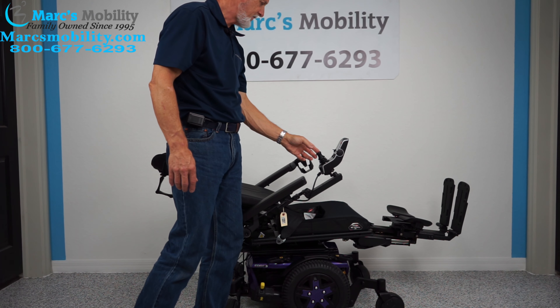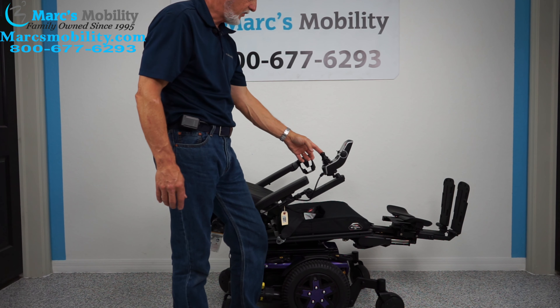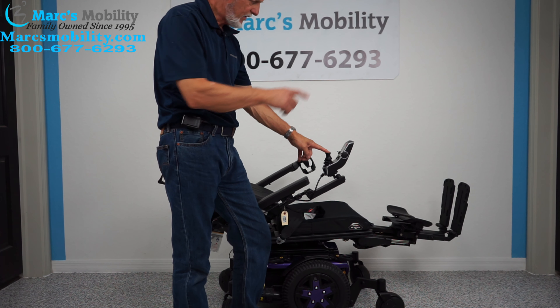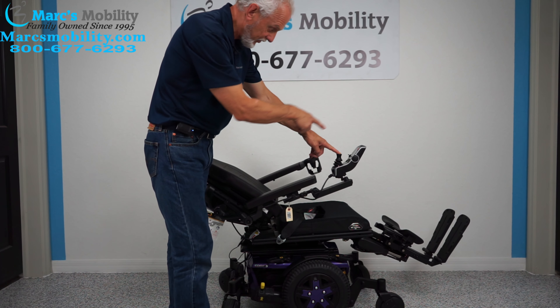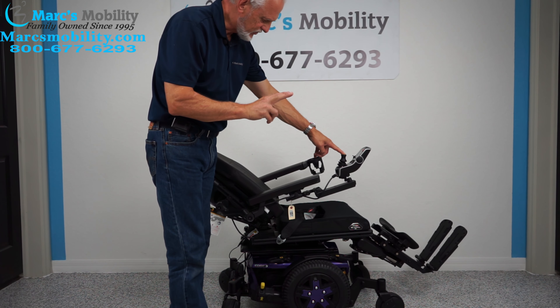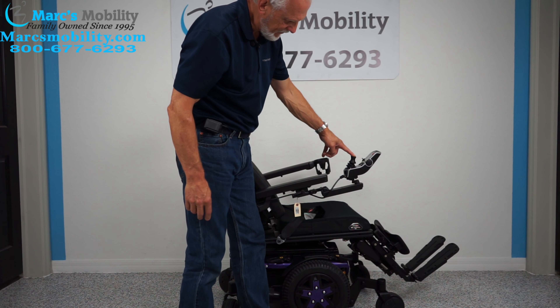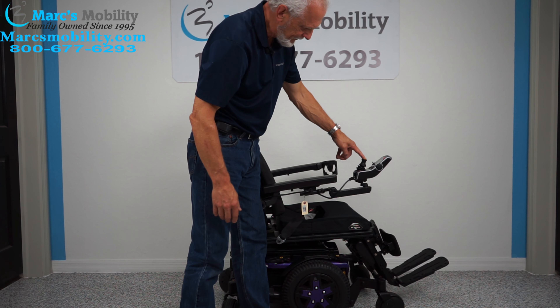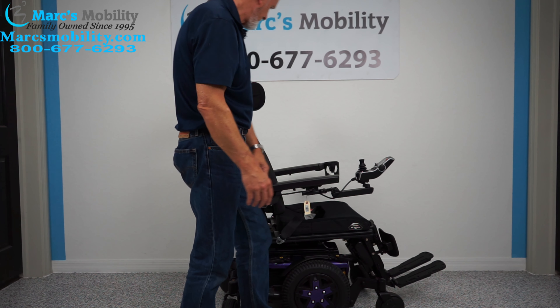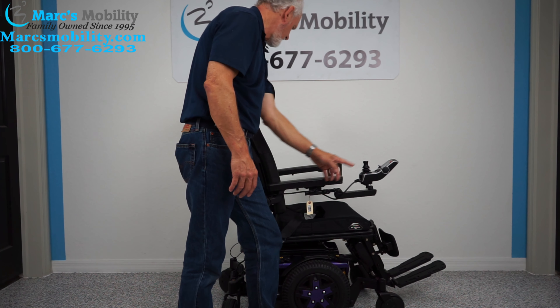I'm going to bring the seat back up. Actually, I'm going to do two functions at once — I'm going to bring the legs down and the back up. I'm having the back yellow and the feet yellow on the screen, so I'm doing two functions at once. When you're outside also, leave those legs out a little bit — it gives you more clearance. Now I'm going to bring them back a little more forward.